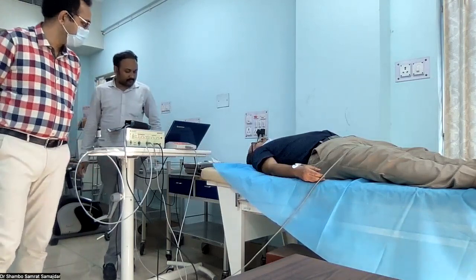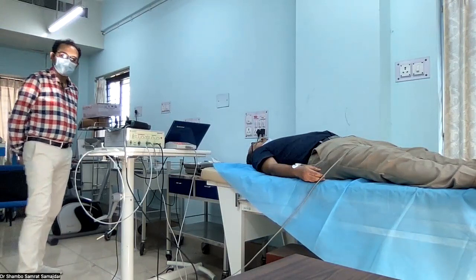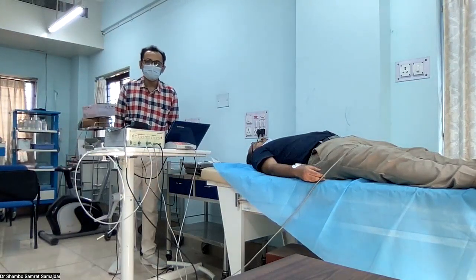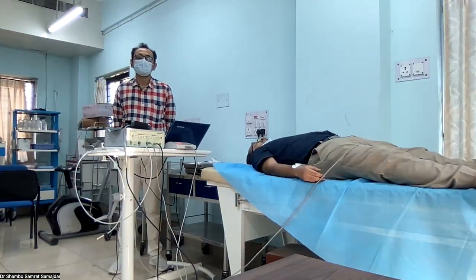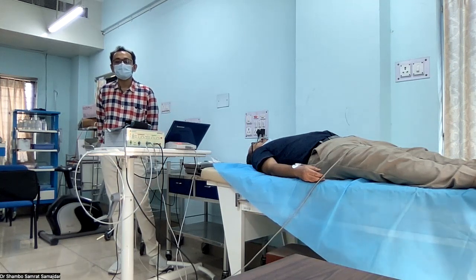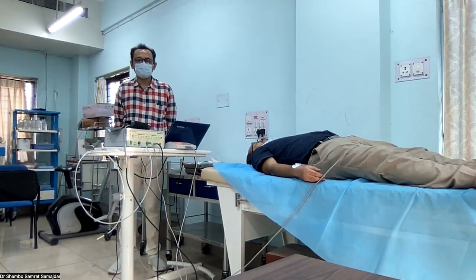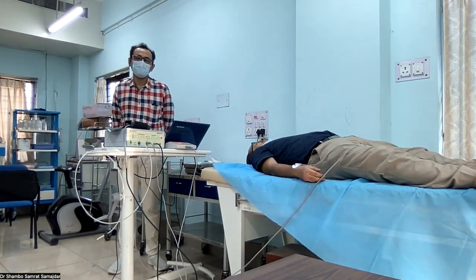So actually we are doing here the ECG for at least 5 minutes, and 5 minutes means we need to check the heart rate variability. Here by this heart rate variability testing we will get a knowledge regarding 3 parameters: LF, HF and VLF. So actually the machine is going to translate the RR interval into the frequency domain analysis, and by which we will get the values of LF, VLF and HF.